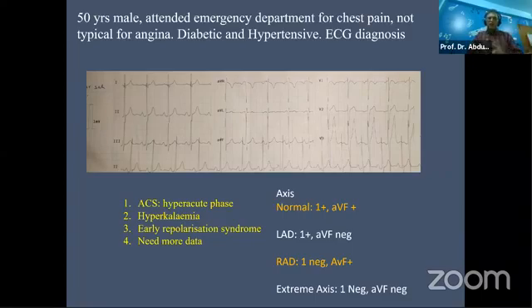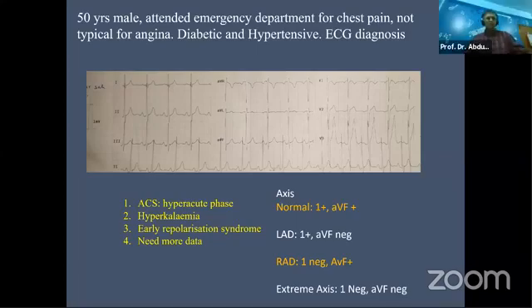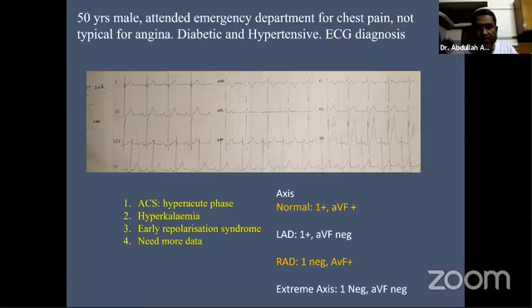Whenever the QRS complex is positive in lead 1 and aVF, it's a normal axis. Please mute. So that's very easy. And it's a beautiful ECG. Whenever you get a very tall P or tall T wave, look at the standardization. Make that a habit. Tall P, tall T, look at standardization. Very simple. Wadud, sir, regarding axis, what Shahabuddin Bhai told, the most equiphasic deflection is in aVL, and its perpendicular lead is lead 2.